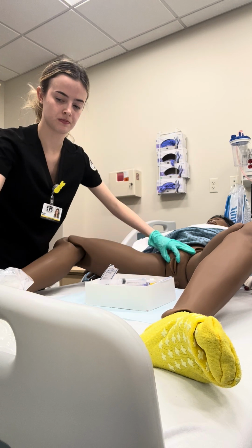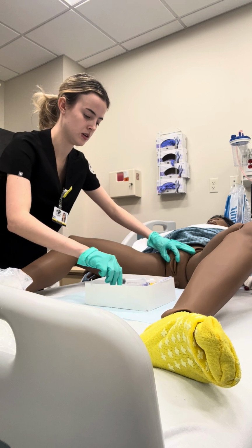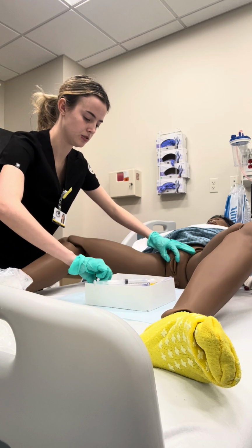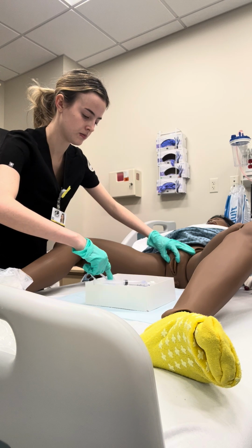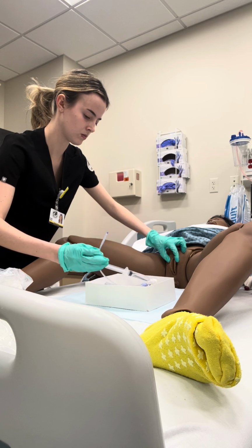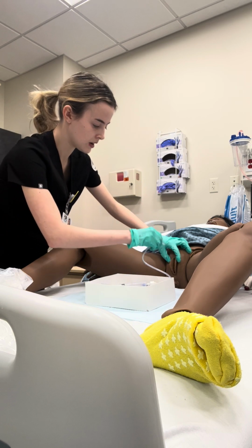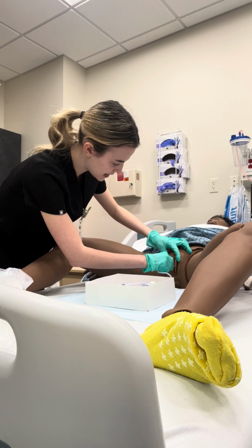Okay. Then I'm going to get my catheter. And insert. Just breathe normally for me, okay?